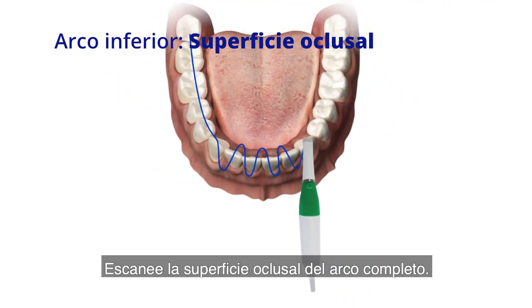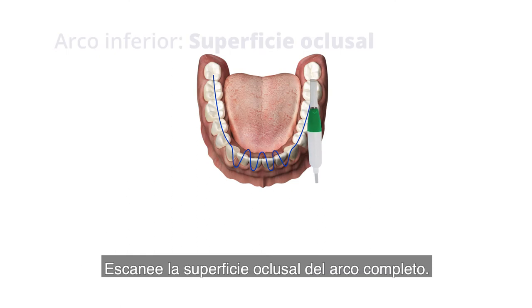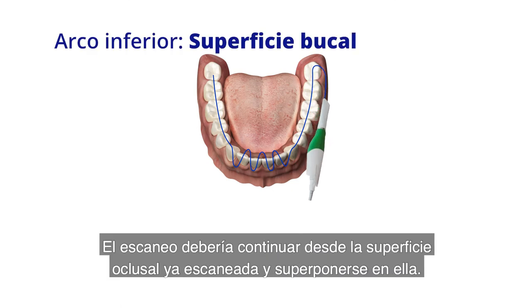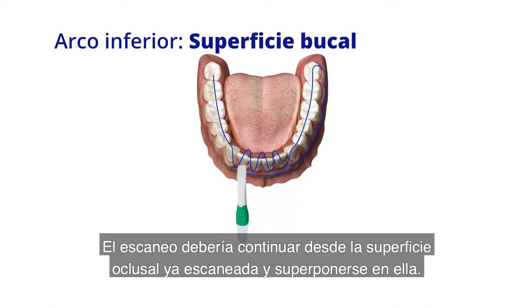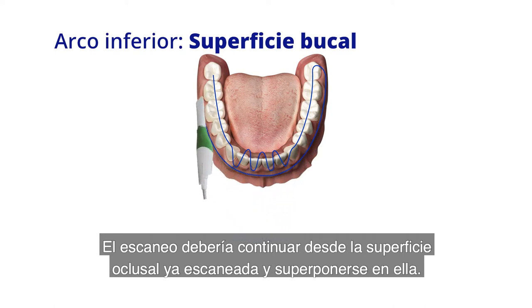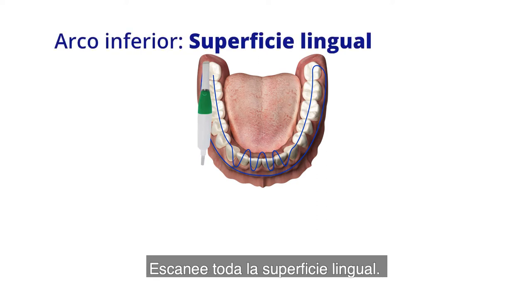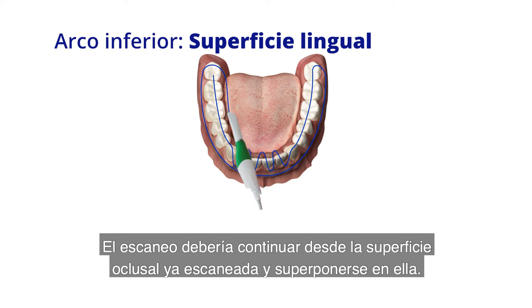Scan the occlusal of the entire arch. Scan all of the buccal — the scan should continue from the occlusal surface already scanned and overlap with it. Then scan all of the lingual, continuing from the occlusal surface already scanned and overlapping with it.